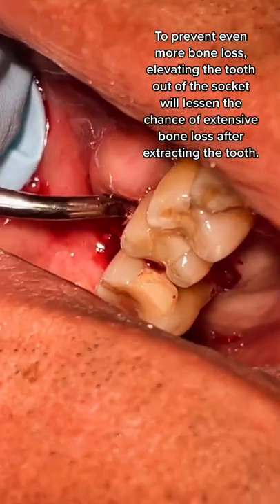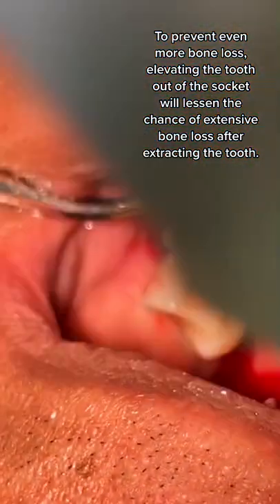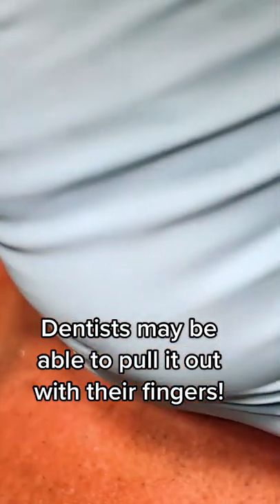To prevent even more bone loss, elevating the tooth out of the socket will lessen the chance of extensive bone loss after extracting the tooth. Dentists may be able to pull it out with their fingers.